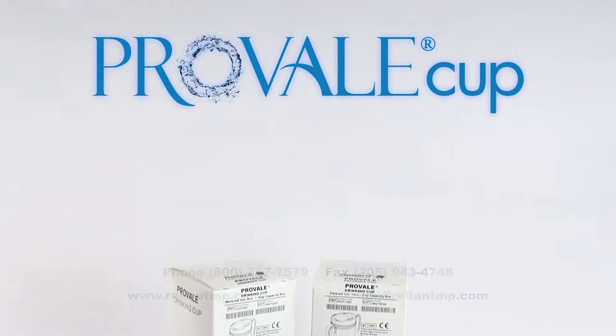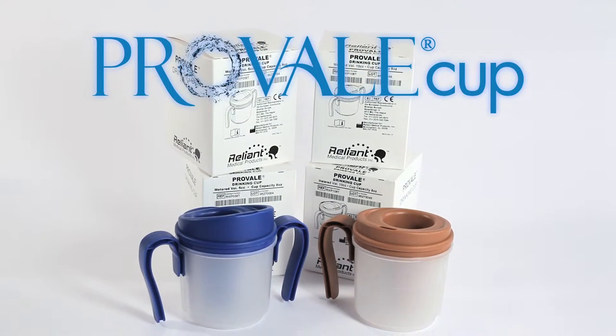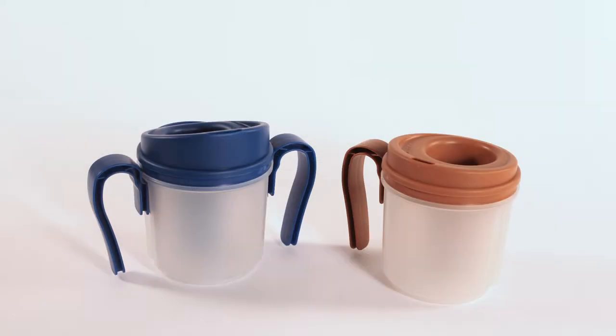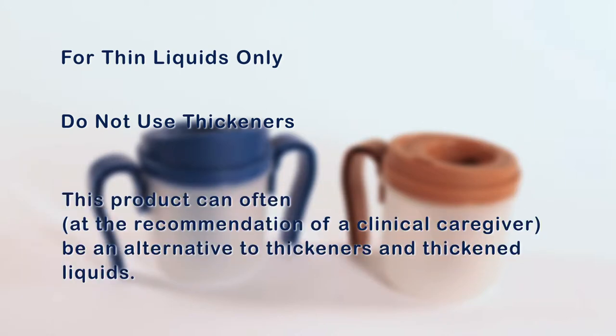The ProVail Cup is designed for patients with dysphagia or swallowing disorders and delivers a fixed amount of thin liquid, small sips with each normal drinking motion. The cup is for thin liquids only. Do not use with thickeners or thickened liquids. This product can often, at the recommendation of a clinical caregiver, be an alternative to thickeners and thickened liquids.